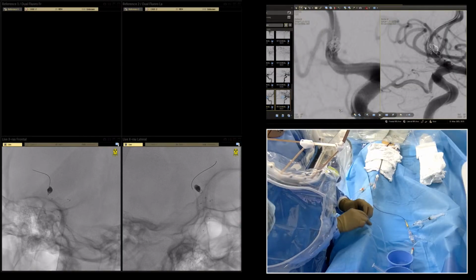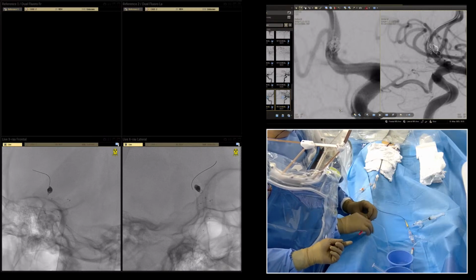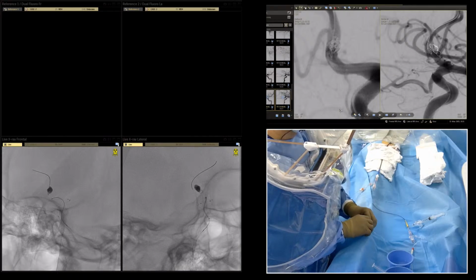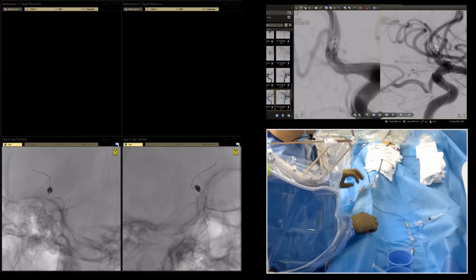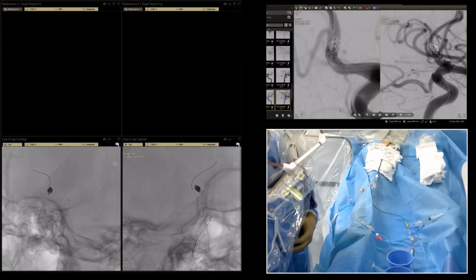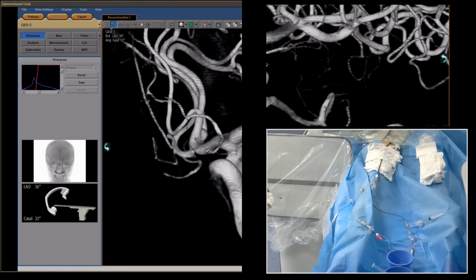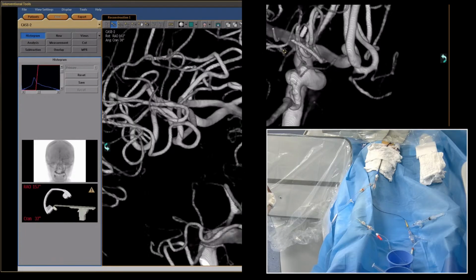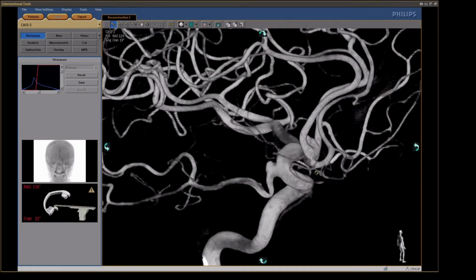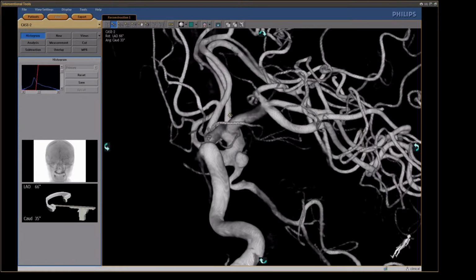The artery was fragile, and with the coil or the tip of the microcatheter it was ruptured. I think the indication for this treatment was clear. If it ruptured in this condition, it may rupture in any condition. Yes. Okay. Let's see. It's something like this. It's a wide neck and okay, I need to go from this side.